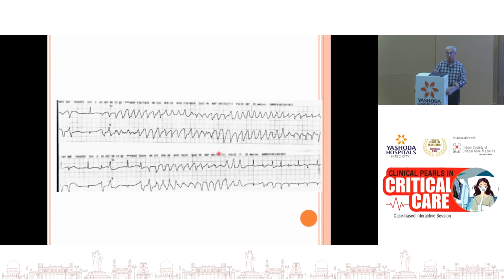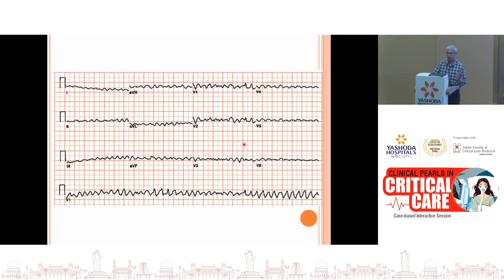And this patient, while he was being observed in the hospital, the same boy, showed this kind of interval. So this is what typically happens in a long QT syndrome patient. Because of the long QT, because of the increased vulnerability of the heart for polymorphic ventricular tachycardia, whenever there's an ectopic which falls at a vulnerable period in the cardiac cycle, this initiates this kind of polymorphic ventricular tachycardia or torsades de pointes, which can rapidly degenerate into ventricular fibrillation and cardiac arrest.